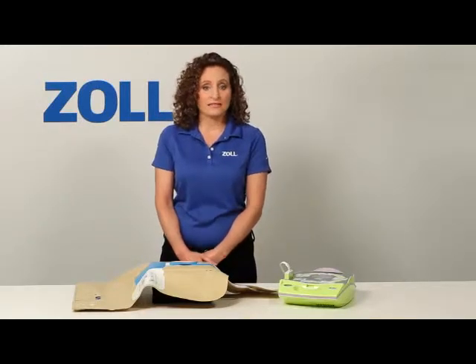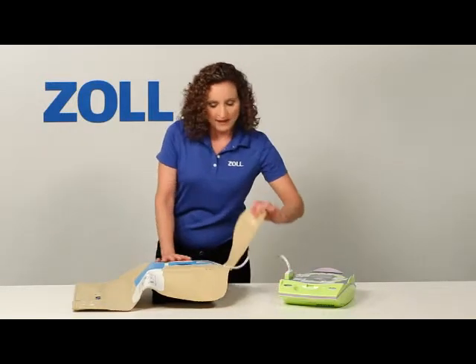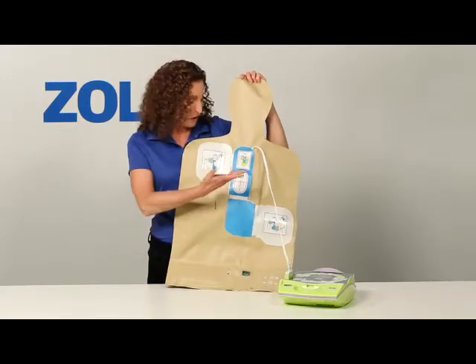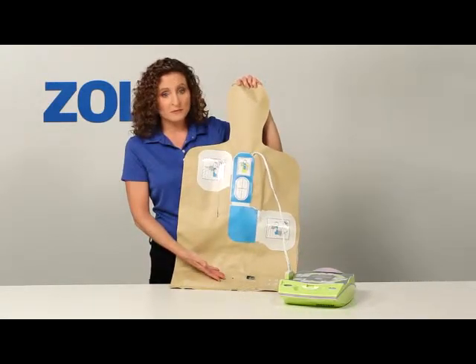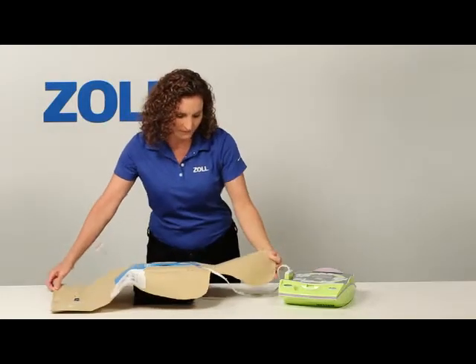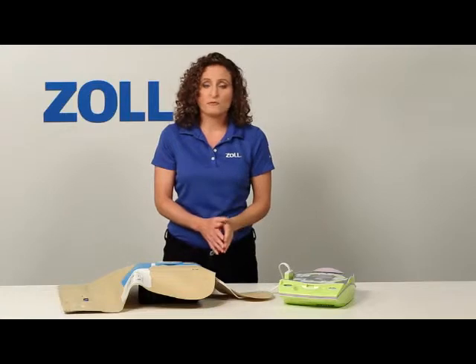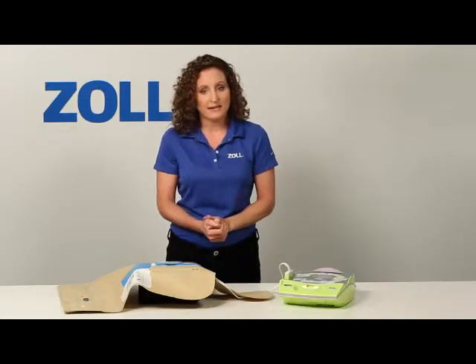Now I will act out a rescue and let you see what the AED Plus does during CPR. This represents a collapsed victim with pads already placed. It has a heart simulator built into it. The pads are already attached, but I will act out placing them. Notice how the AED Plus walks me through the rescue and how it supports my CPR with real CPR help.